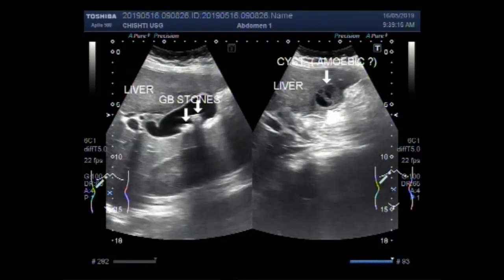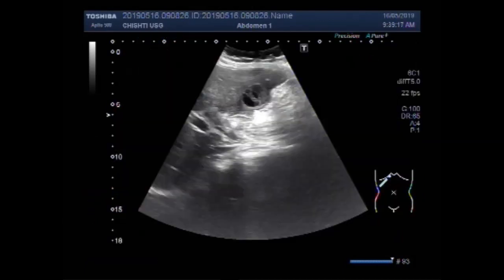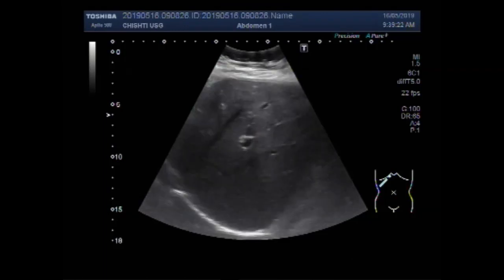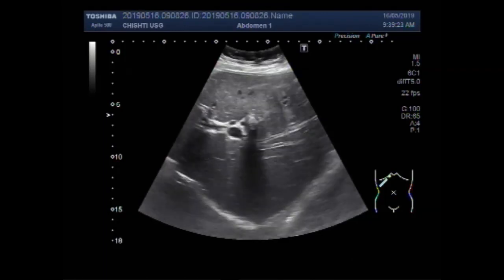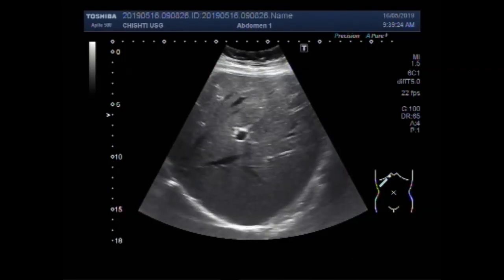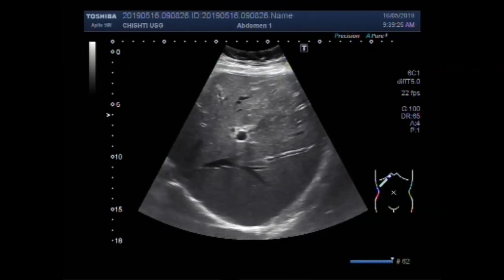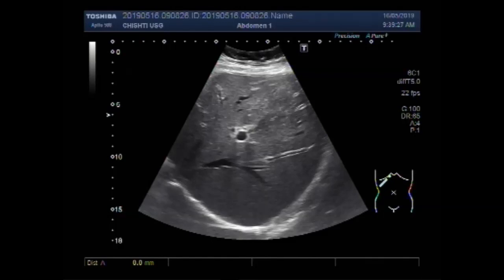Dear viewers, I hope you are all fine. This ultrasound video shows multiple stones in the gallbladder — cholelithiasis — along with an amoebic cyst.